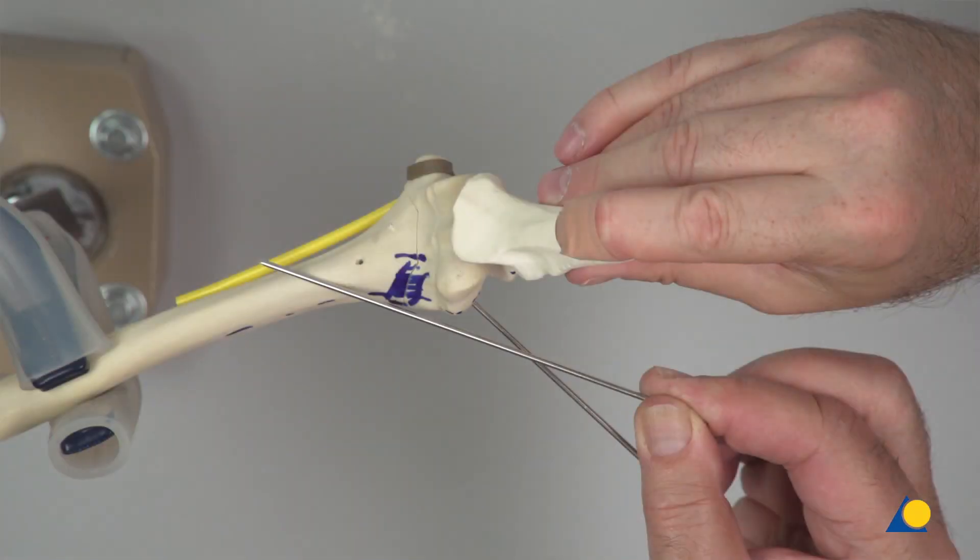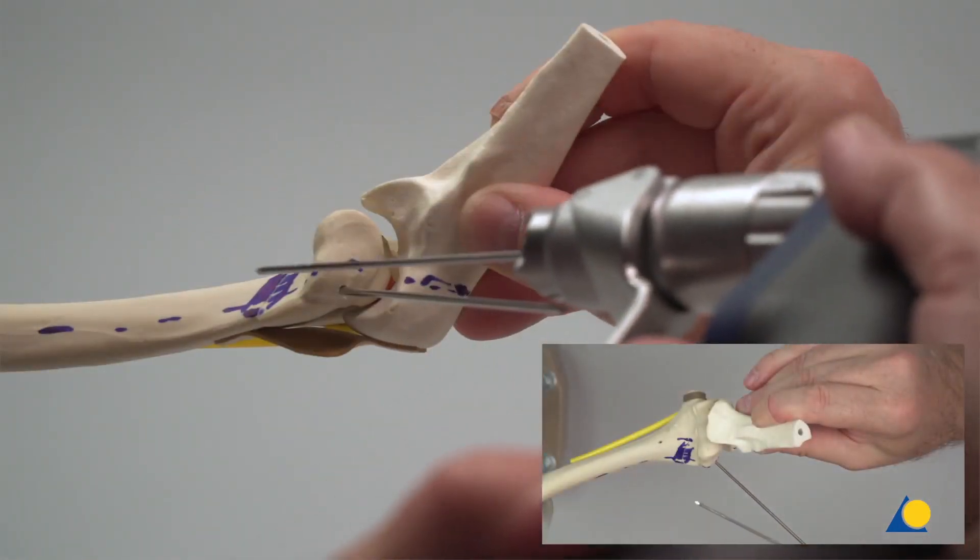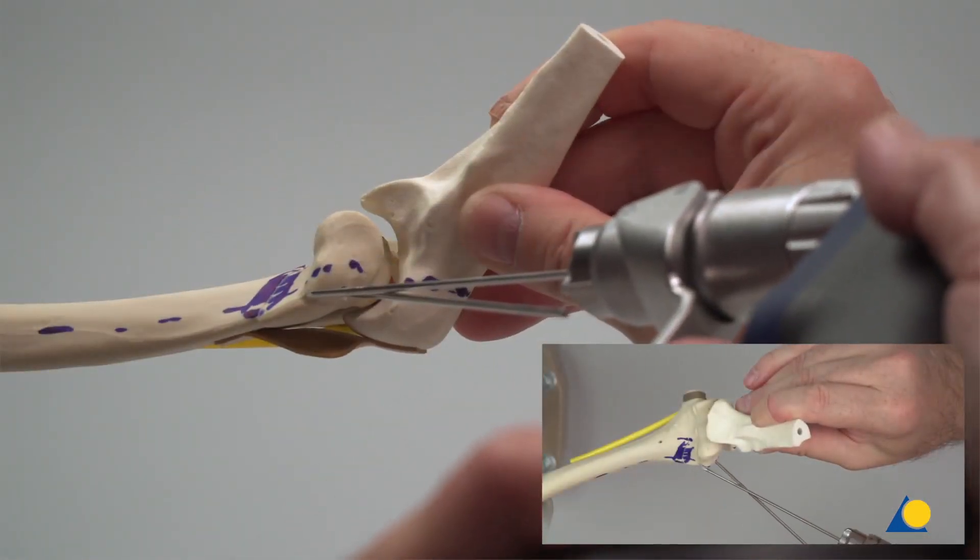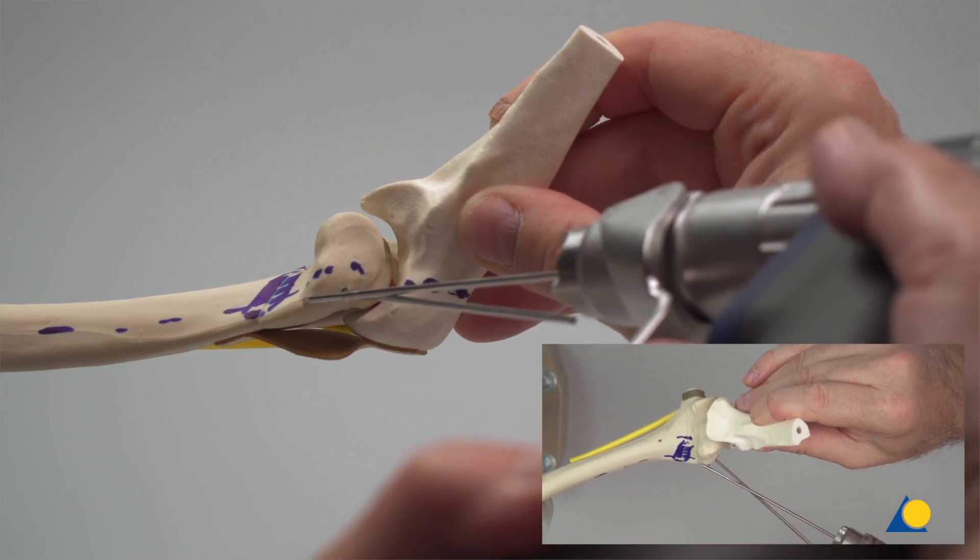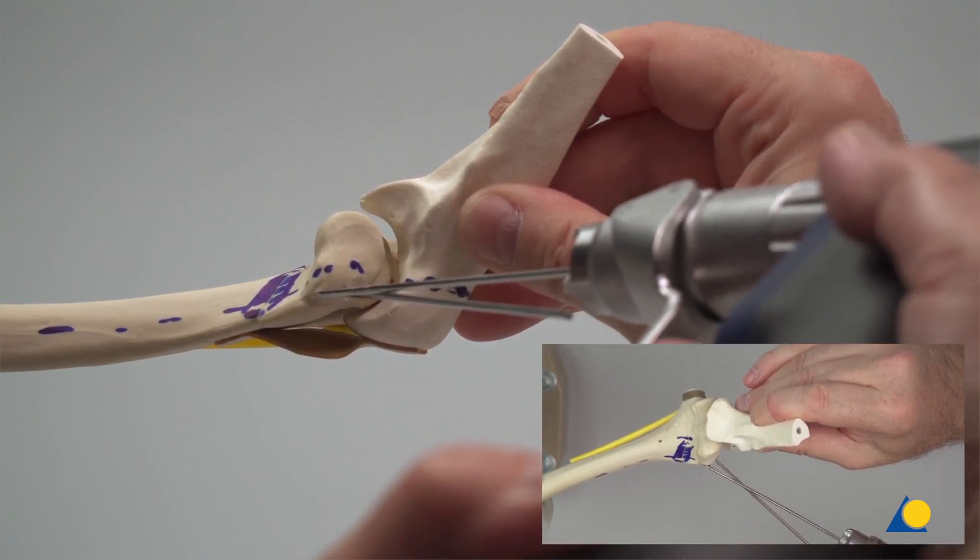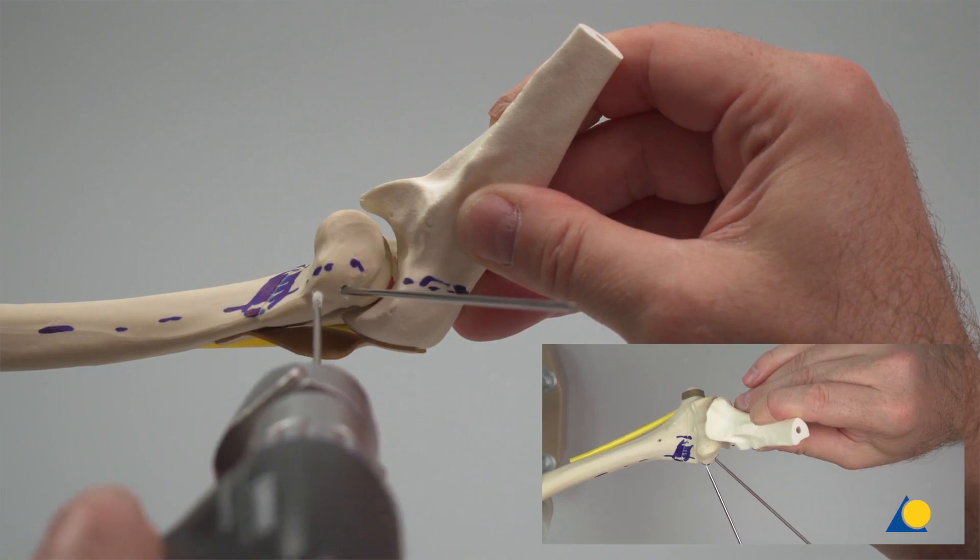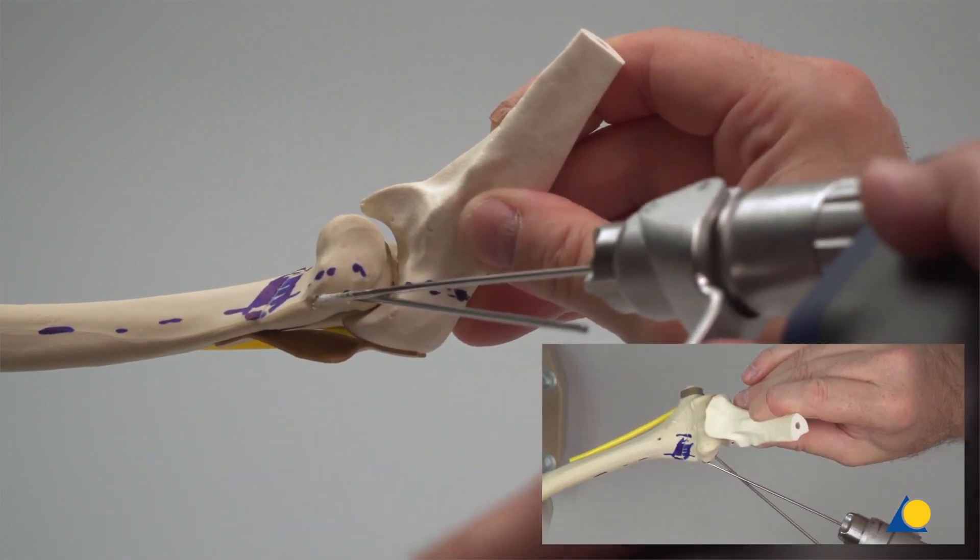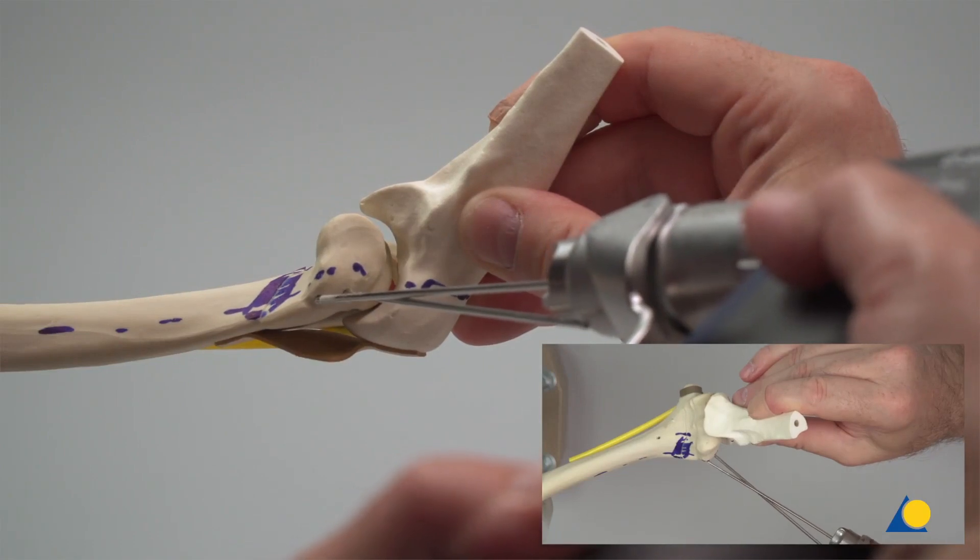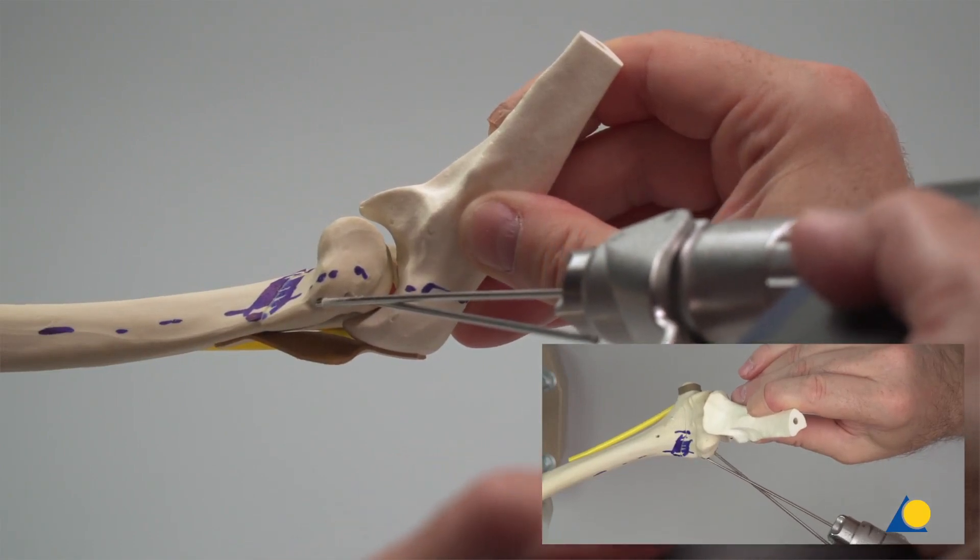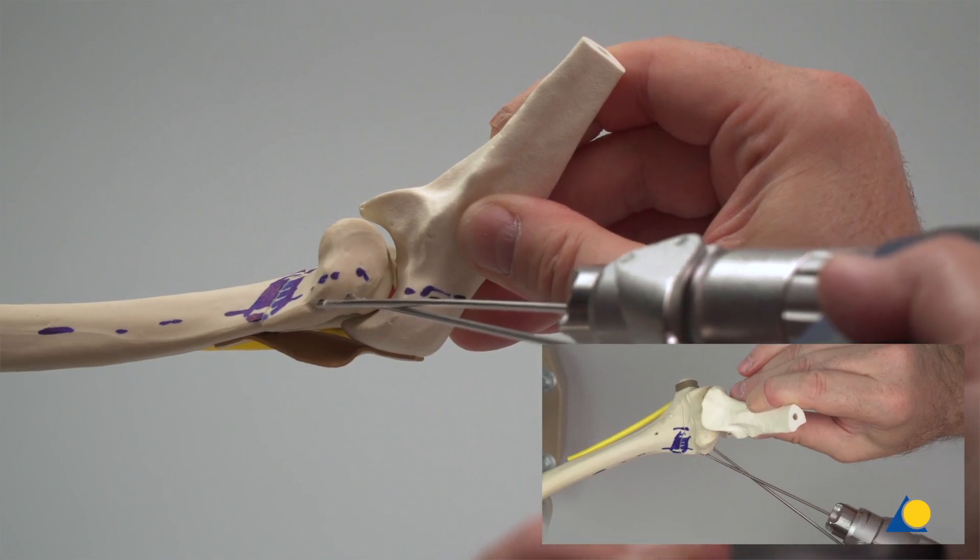The second K-wire is planned for insertion towards the humerus shaft axis diverging away from the first K-wire. Note that the second K-wire will cross the first K-wire outside of the skin. Note that achieving initial purchase of the K-wire in the desired location may pose a challenge. As there is a risk of the K-wire slipping off the bone because the entry angle is very oblique, the K-wire can initially be positioned perpendicularly on the bone and a small indentation created. With the risk of slipping addressed, the K-wire is then repositioned to the desired angle and insertion towards the axis is continued.